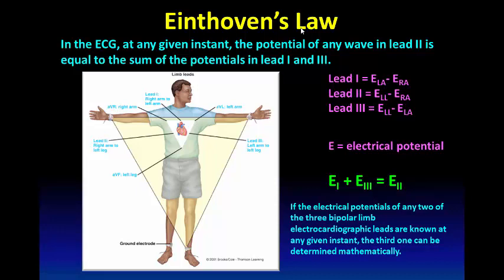This relationship is also used to make sure that our ECG connection and the placement of the electrodes which we made while recording the ECG are correct.